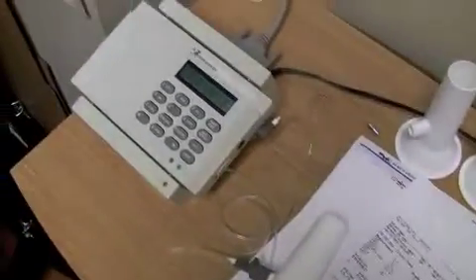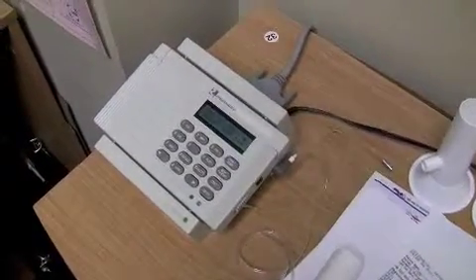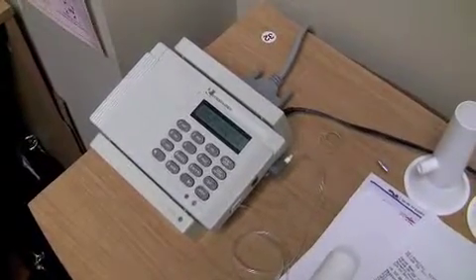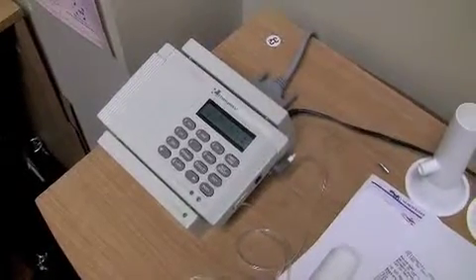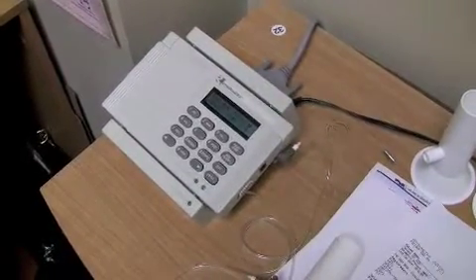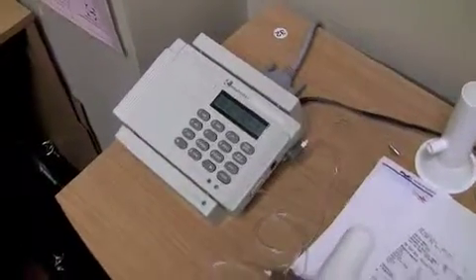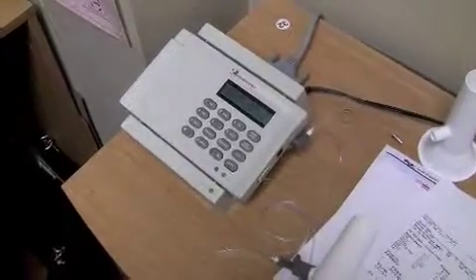Also remember that the machine has to be calibrated before every test. Now, the exception to that rule is if you've got multiple people coming in scheduled for that same day, then you only have to calibrate it 1 time. But if you calibrate the machine, you do a test, and someone comes in the very next day, that machine has to be recalibrated.